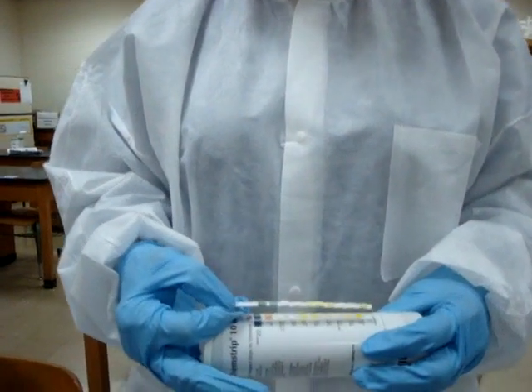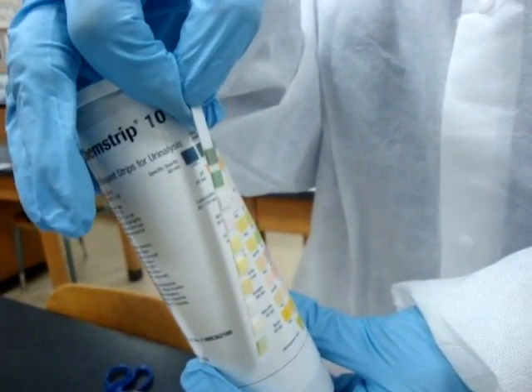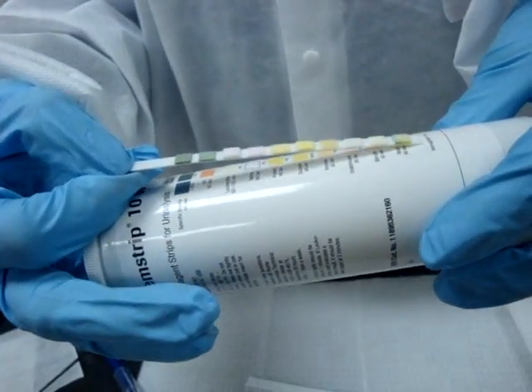A couple of things to remember: timing is definitely critical. We do not touch the pads with our fingers. We always close the lid. We always hold the strip horizontally to read, because if we read vertically the chemicals will run from one pad to another and give us erroneous results. So always read horizontally. And that is how you perform a urine dipstick.